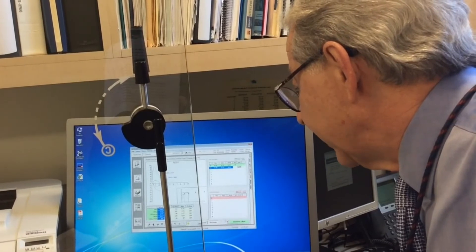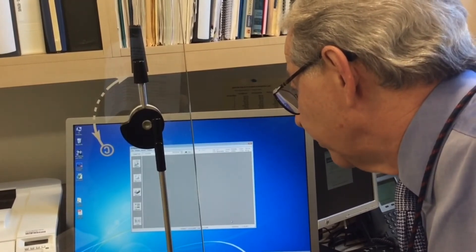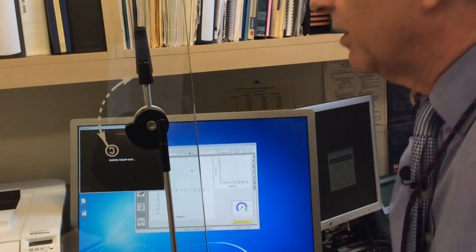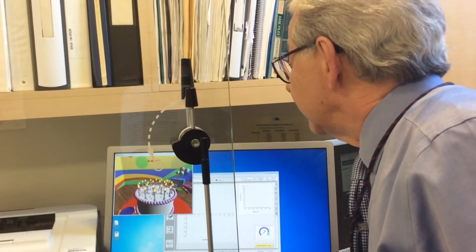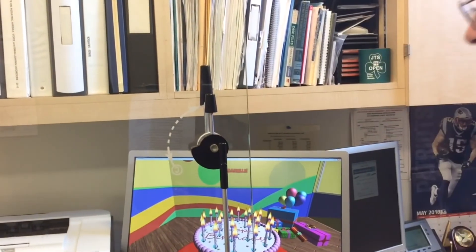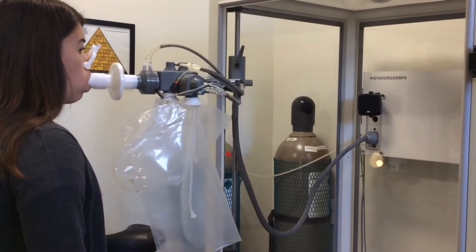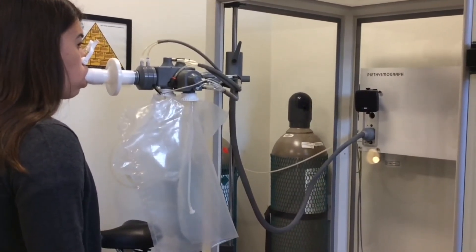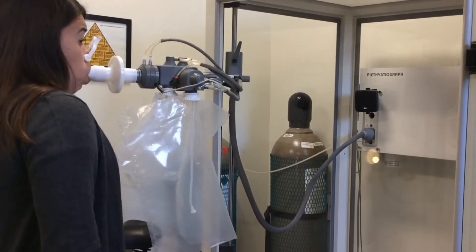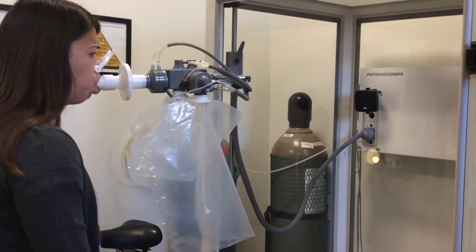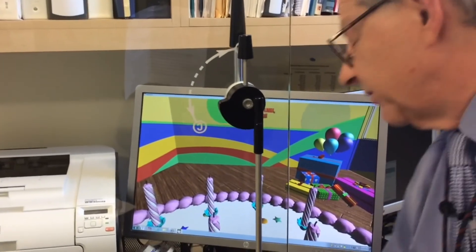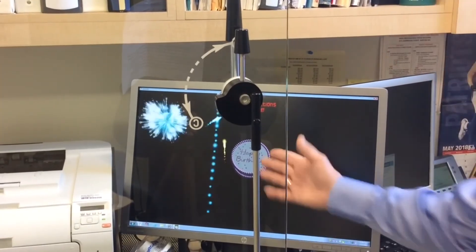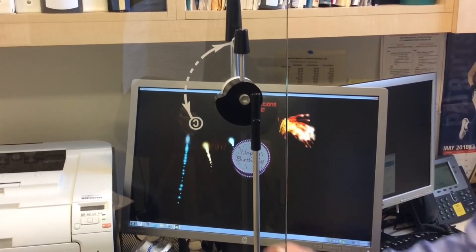We have a birthday cake with candles as a visual incentive. We're going to do the same thing — I'll coach her through. We'll make this cake nice and big. Just take your time, Danielle. Just breathe easy. When you're ready, take a big breath in, hit it hard, push hard, go, go, go, go. Keep going. Deep breath in at the end. Danielle managed to get 100% of her vital capacity — so she gets some fireworks and doesn't get the cake in her face.